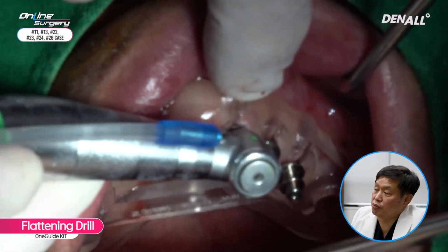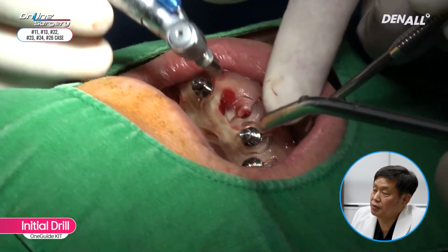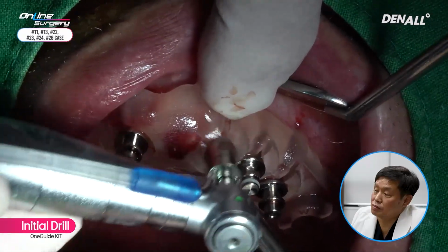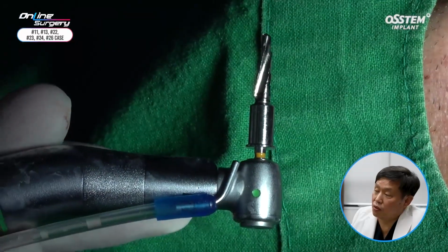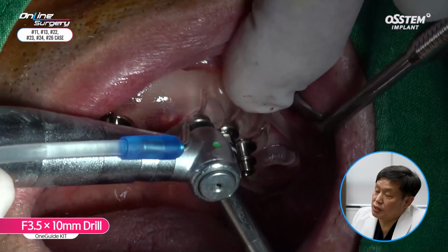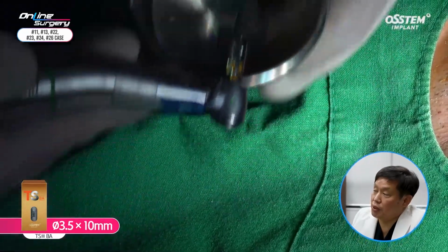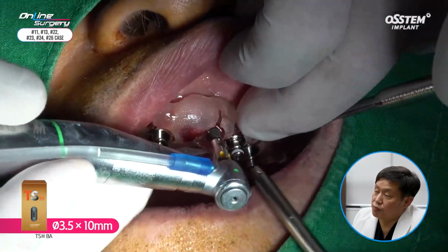Number 22. As was done earlier, the flattening drill was used, followed by initial drilling. Initial drilling was done. The bone was fairly favorable. The 3.5 by 10 mm OneGuide drill was used. A TS3 3.5 by 10 mm BA surface implant was placed. In number 22, the diameter was 3.5.